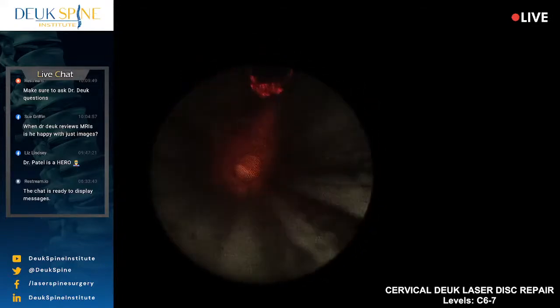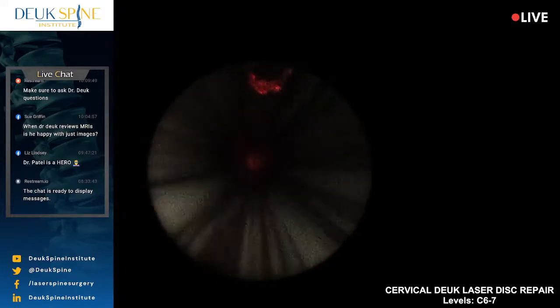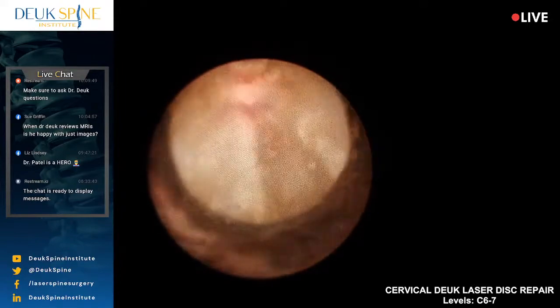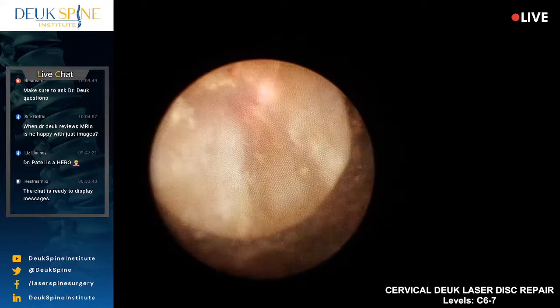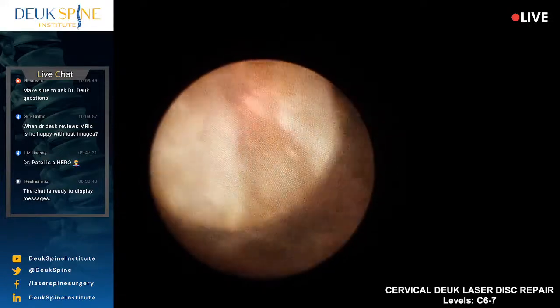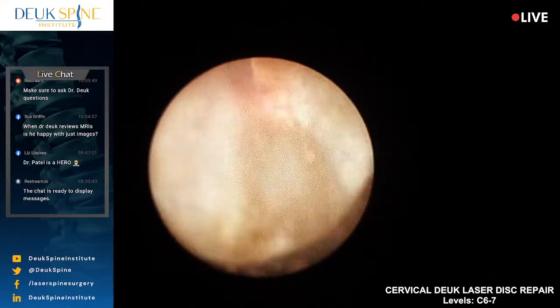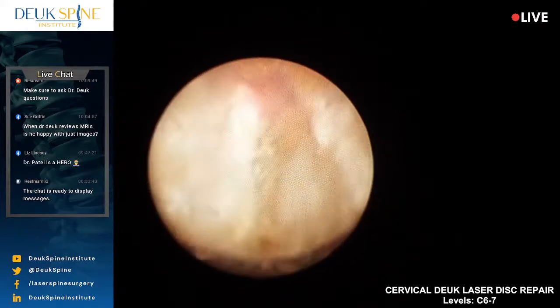Typically, I remove bone spurs that... Do we have a lot of these working cannula? Yes, sir. Good. I want to make sure we have plenty of them. I'm just going to... This is all scar tissue right here. This is like literally holding the bones, C6 and C7, keeping them from moving. Bone spur.